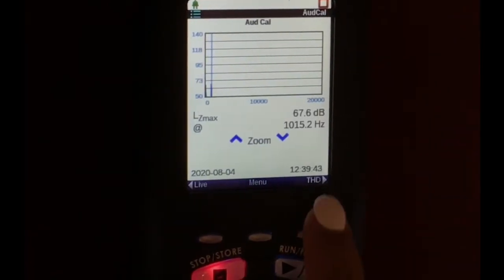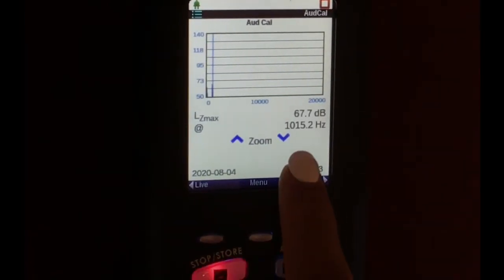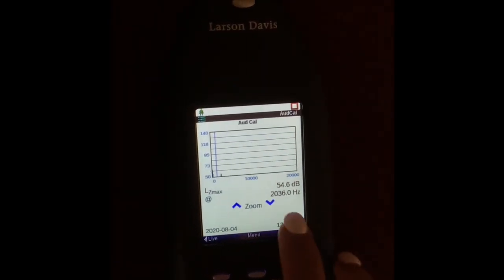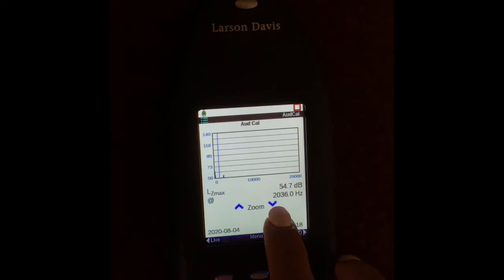This is what the SLM found. It recorded 1015.2 Hz at 67.7 dBs. We then did the same thing but changed the frequency to 2000 Hz. It recorded 2036.0 Hz at 54.7 dBs. I did not change the intensity from the previous run.